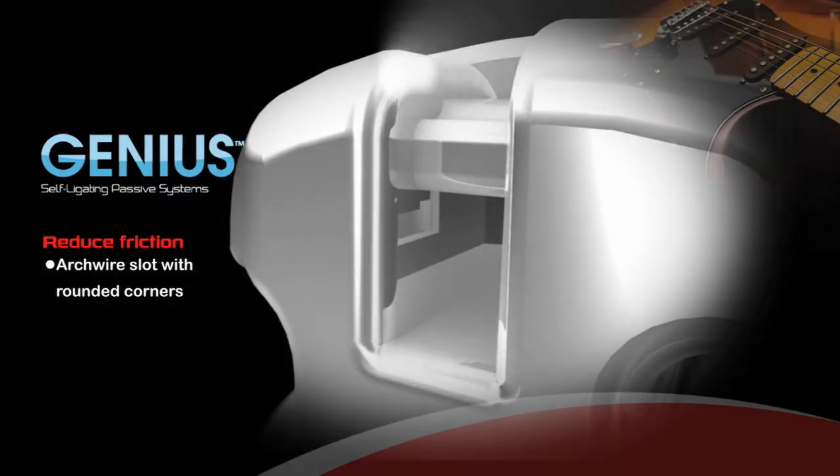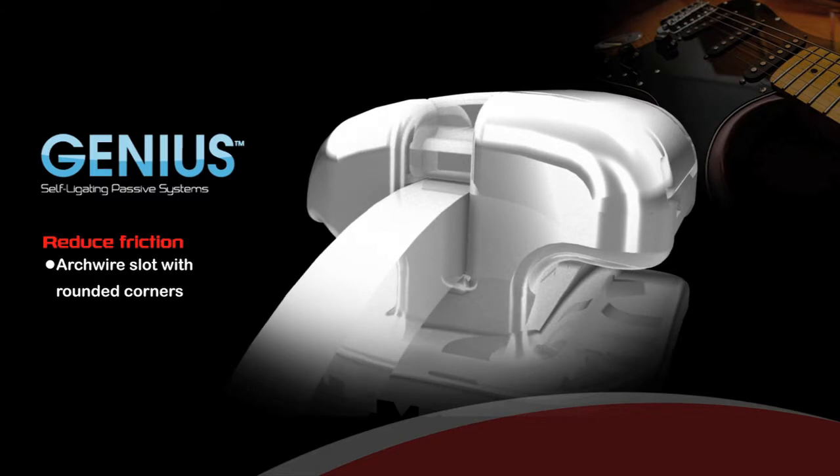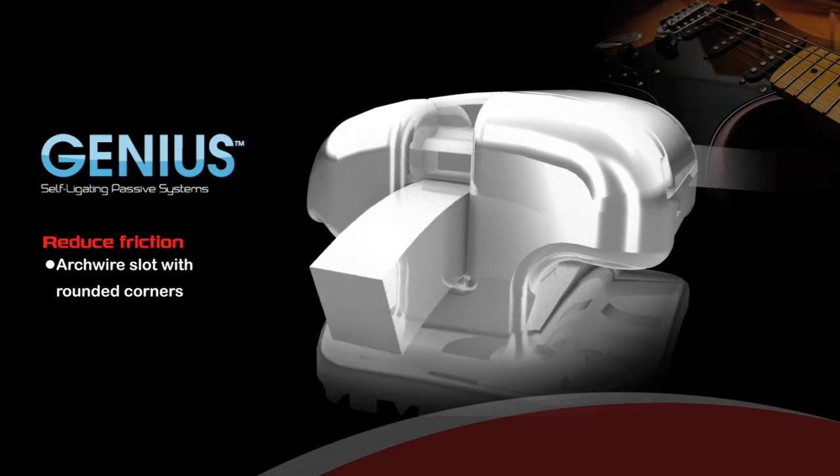Reduce Friction: The Genius archwire slot is designed with rounded corners that help to lower friction when the tooth has high discrepancy.